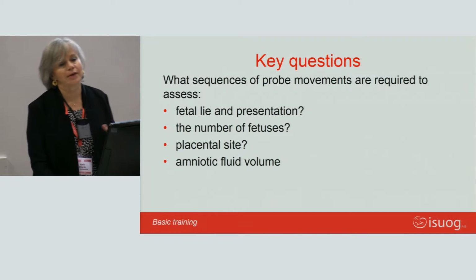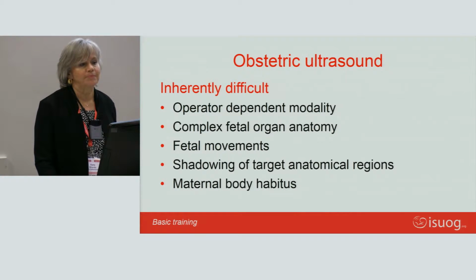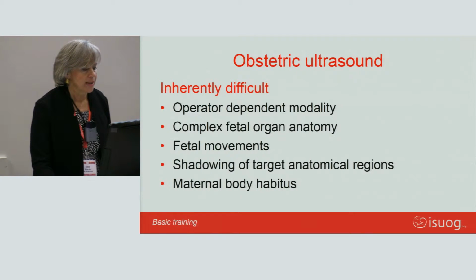For those of you who already have experience with ultrasound, maybe this lecture will seem extremely easy, but I think you have to realize that this is the way you should teach a systematic approach to the use of ultrasound.